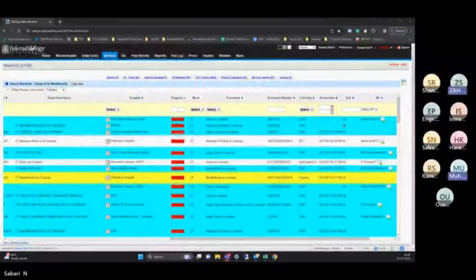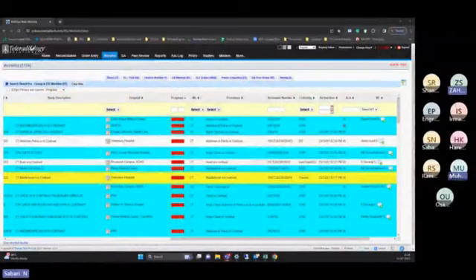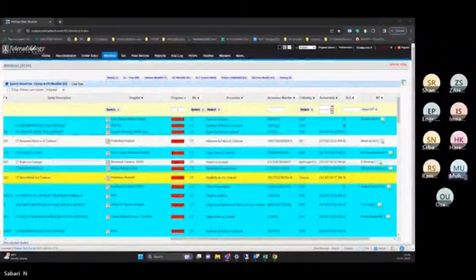मगर सिस्टम स्लो होता चला जाएगा. Yes. जैसे जैसे हार्ड डिस्क बढ़ती जाएगी सिस्टम स्लो होता चला जाएगा. नहीं, मतलब see, that study deletion, whether it's 24 or 48 hours, 1 week or 1 month or 1 year, that is based on the configuration. Based on the configuration, we can do the deletion. So the application will do it automatically. But if you did not configure anything, it will not delete even a single study. Okay.